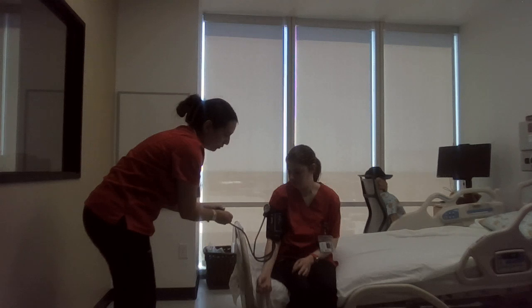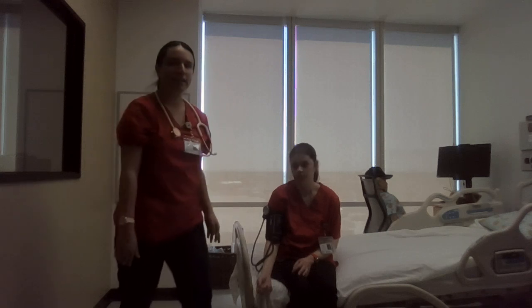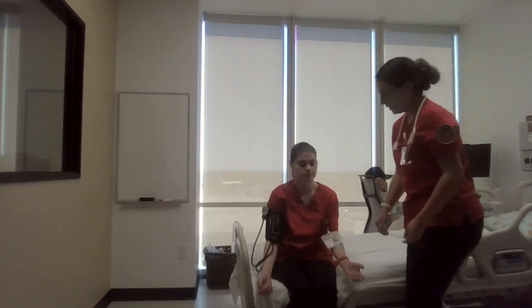I stop feeling the brachial pulse at about 120, so I'll let the arm rest for a minute. And then I will take the patient's heart rate and respirations at this time.